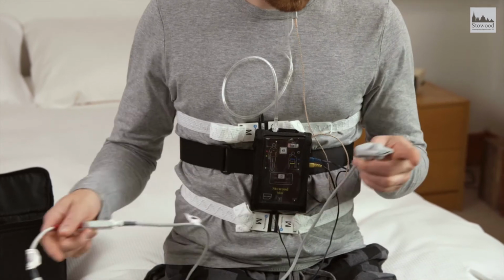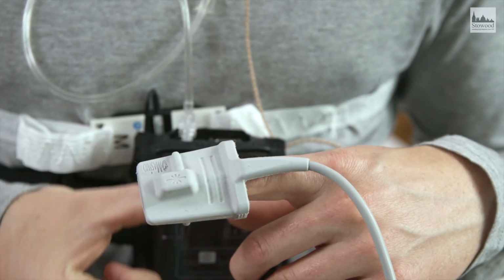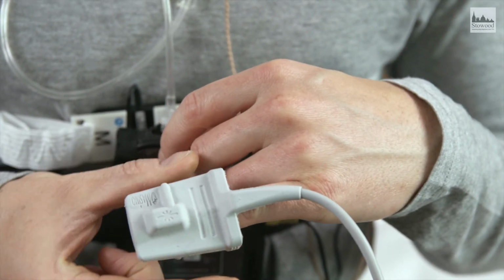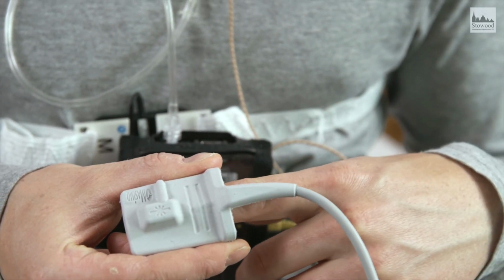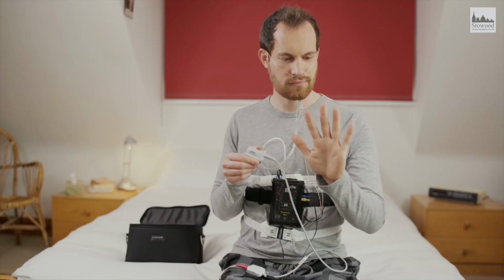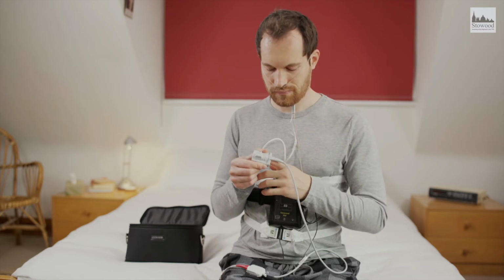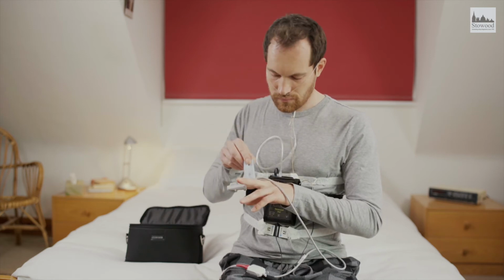Slide the left index finger into the oximeter probe so that it is comfortable. If it feels too tight, use a smaller finger. Be sure to remove any foreign materials from the finger, including nail extensions and nail polish. Once you have removed any foreign material and the sensor is comfortably fitted, secure it with some tape around the cable. Do not put tape around the probe body.